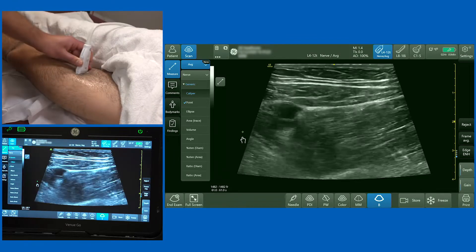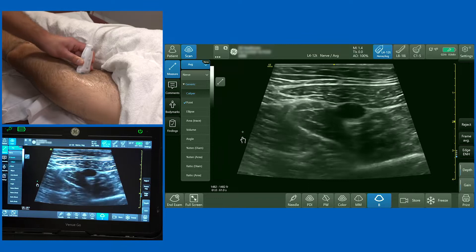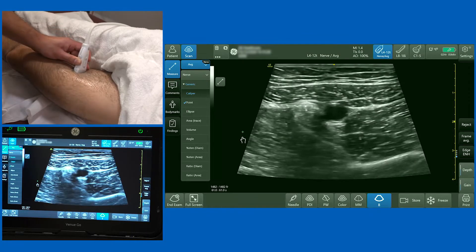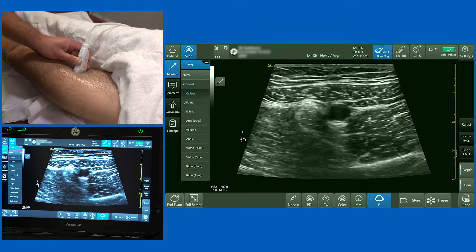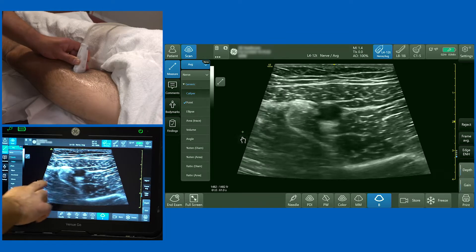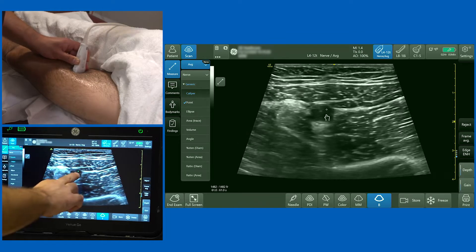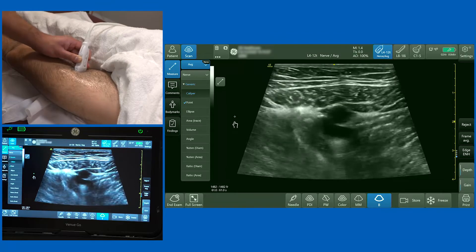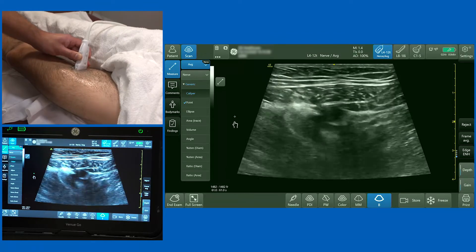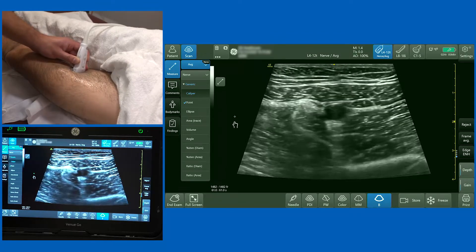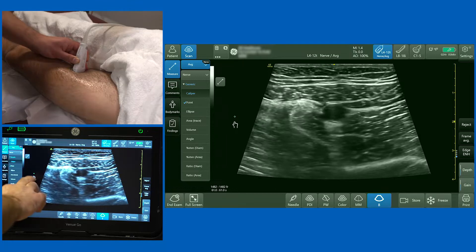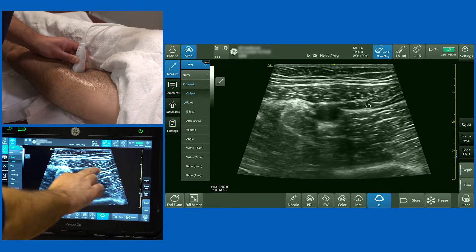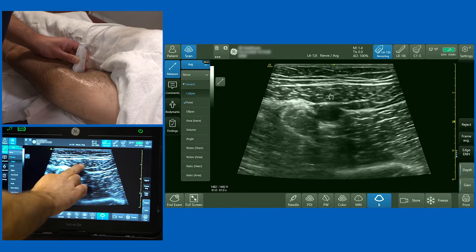I'm going to place the probe in the middle aspect of the thigh and the first thing I want to orientate myself to is the superficial femoral artery. Right in the centre of the screen you can see a nice pulsatile superficial femoral artery. If I release my pressure you'll see the vein below it, and above the femoral artery you've got the structure that forms the roof of the adductor canal — this is the sartorius muscle.